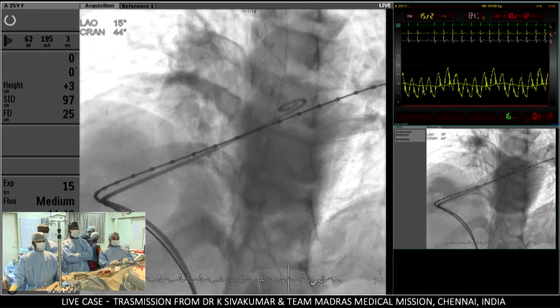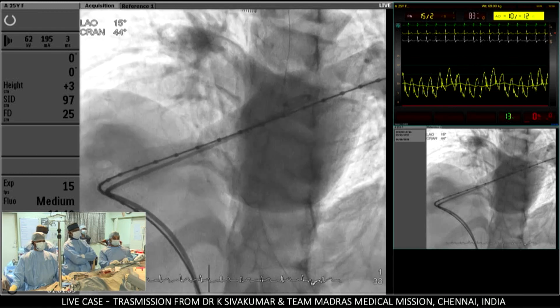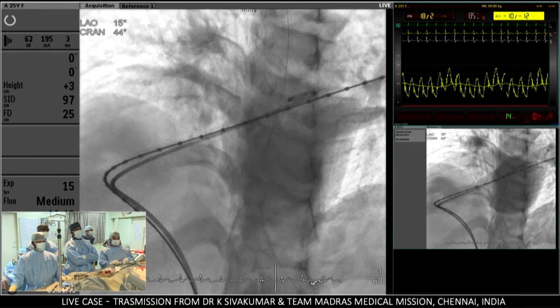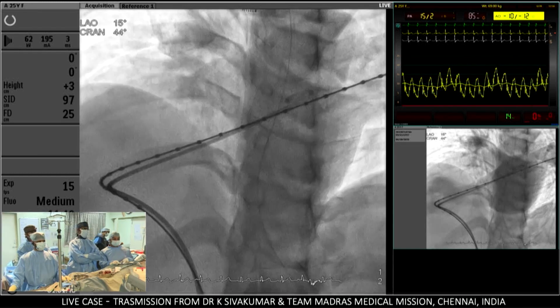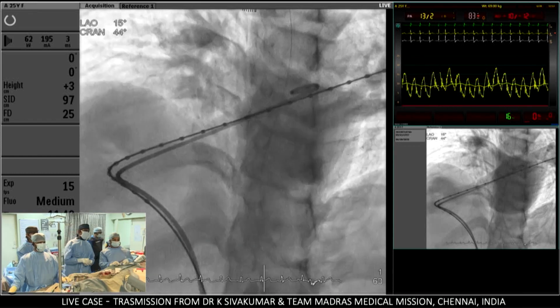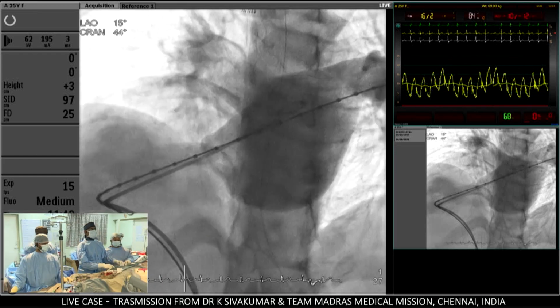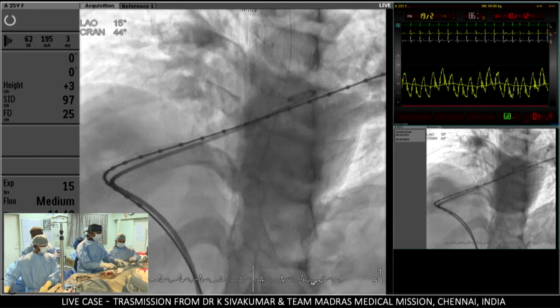We are able to open out the outflow tract, and we are able to see that the expansile right ventricular outflow tract also measured about 32 millimeters with the marker pigtail. We have a Lunderquist wire that is placed within the left pulmonary artery. Any questions, Alison?